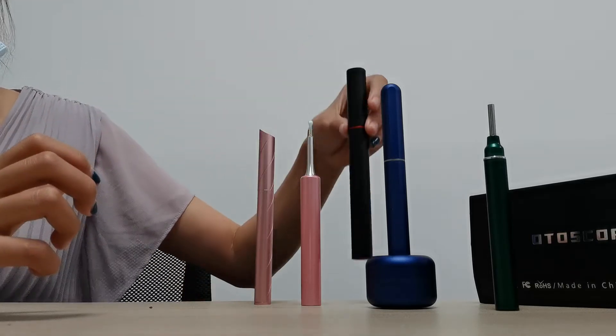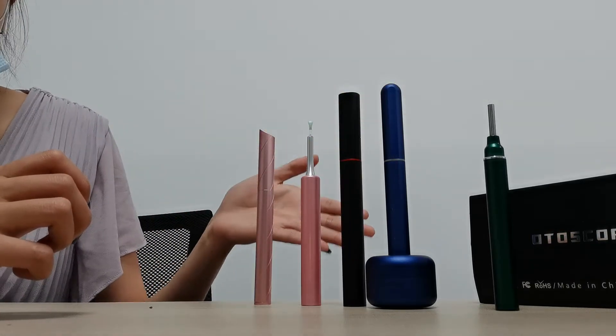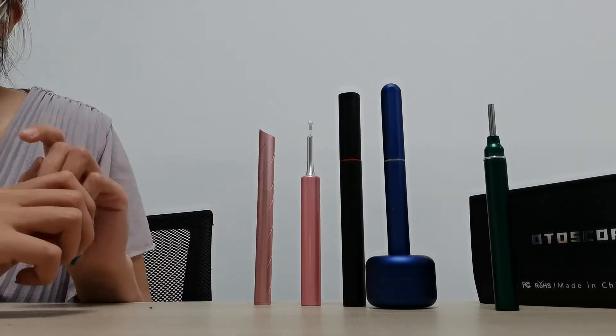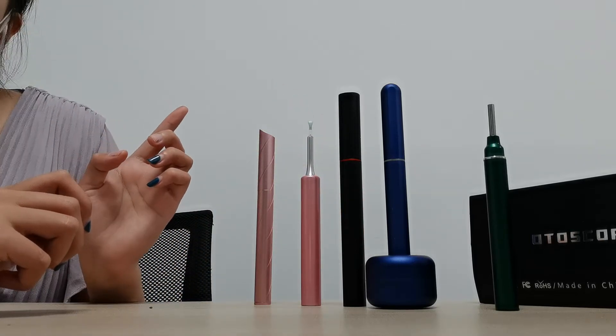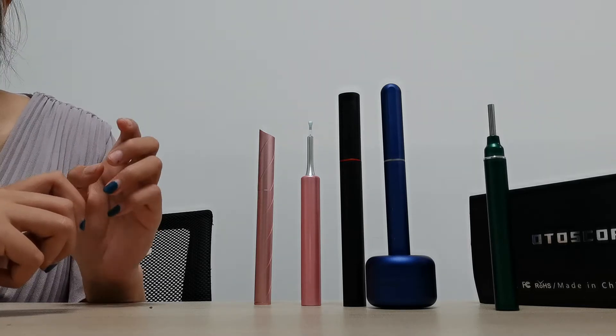The second one is the resolution. These five resolutions are the same. Some sellers will say their resolution is 1mm or 2mm or 3mm, but actually they are all the same.